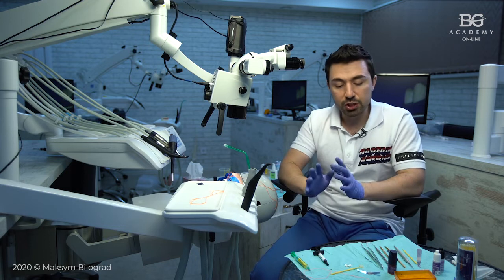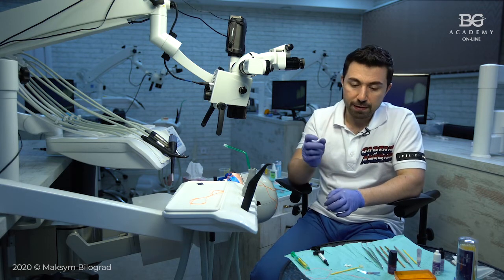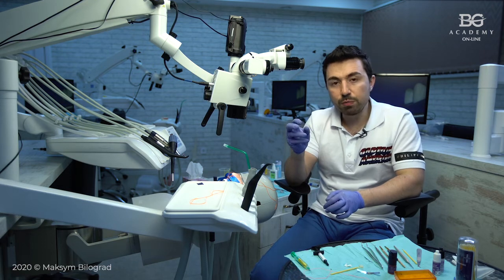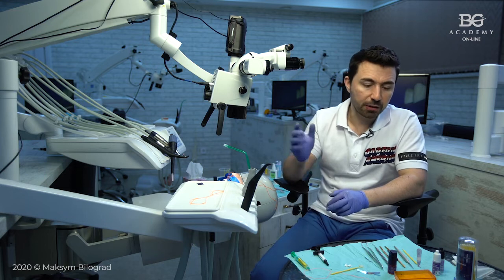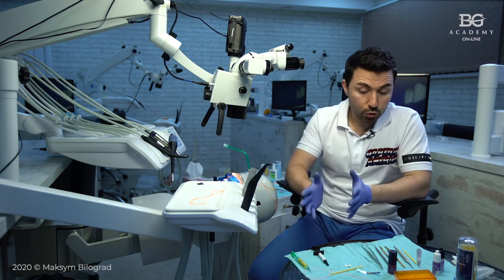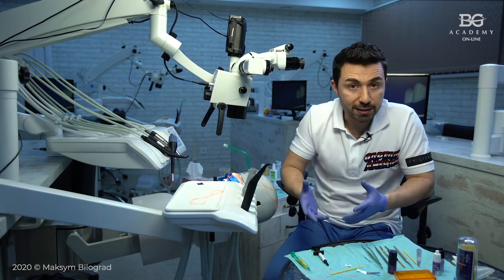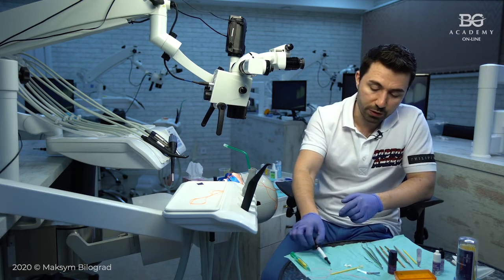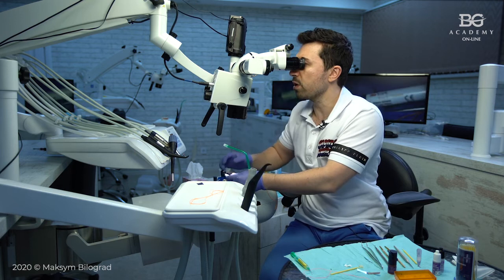Another thing is that some dual cure resin cements have an amine group that can discolor later on. So the color stability is in question in some of them. You can also use specially designed resin cements for veneers, light curable, for example, the one from 3M, RelyX Veneer, like this one.